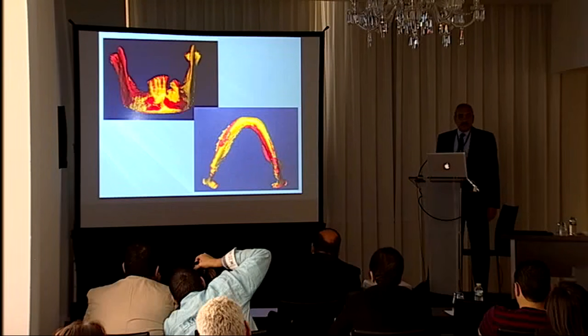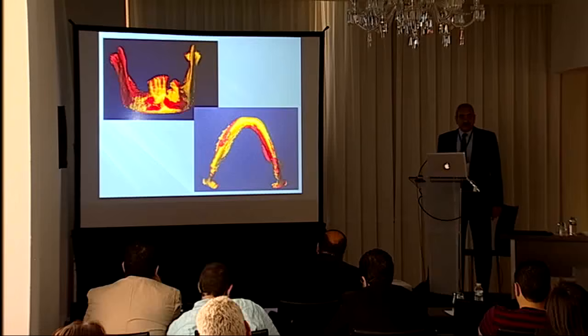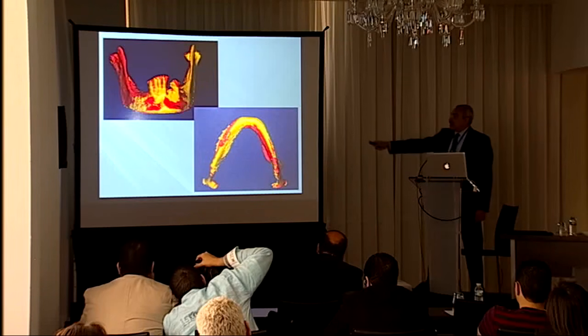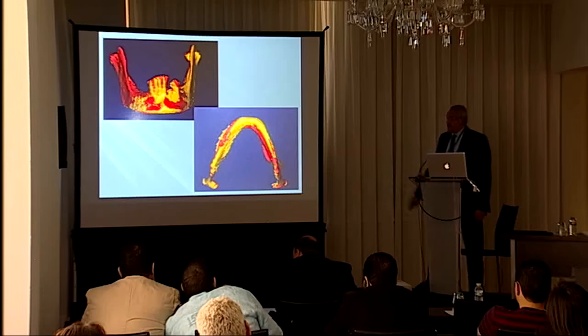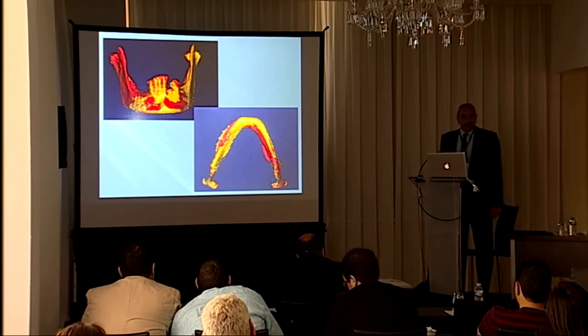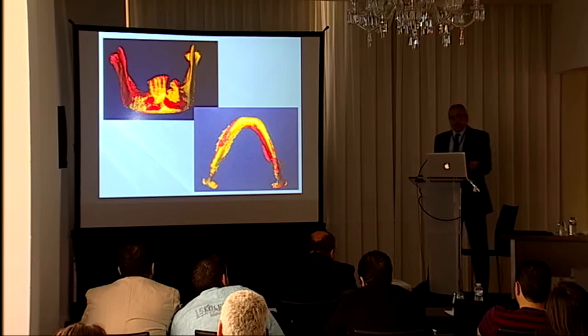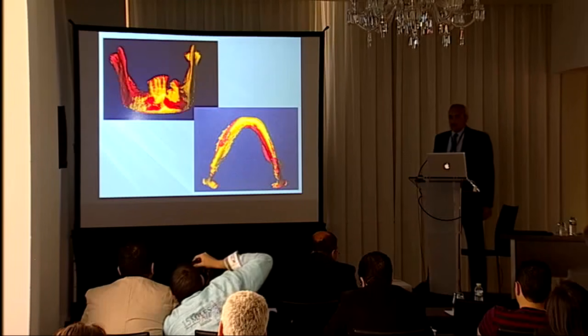And we took it out, and this is the pre and post-operative CT scan superimposed on each other. The yellow is the pre, and the red is the post-operative, and we can see they almost match identically, so we know that those splints guided the surgery the way we planned it pre-operatively.